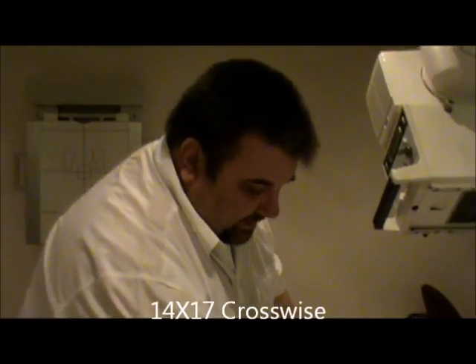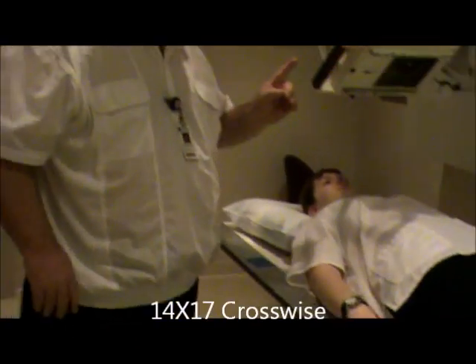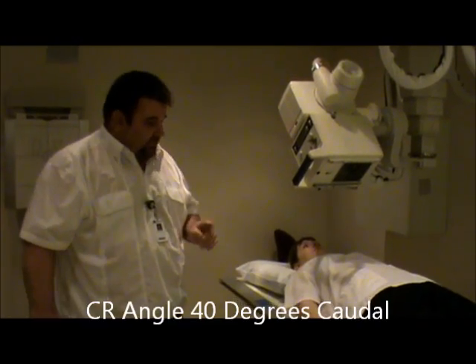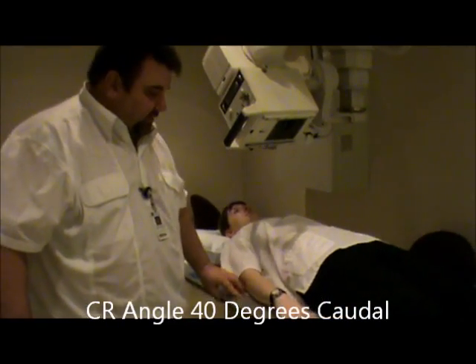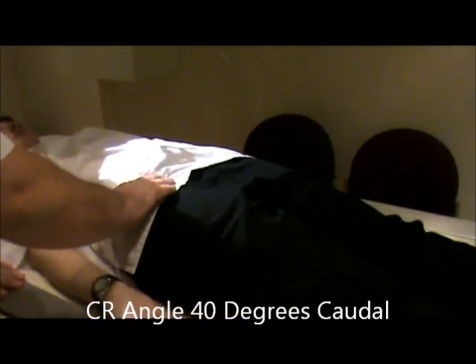We're not going to demonstrate the pelvis because we've done that previously, so we're going to start with the inlet view. Film size is going to be a 14 by 17, and it's going to be crosswise. Our tube angle is going to be 40 degrees caudal, and that's for both male and female. Our centering is going to be where we palpate the ASIS, at the level of the ASIS, at the MSP.